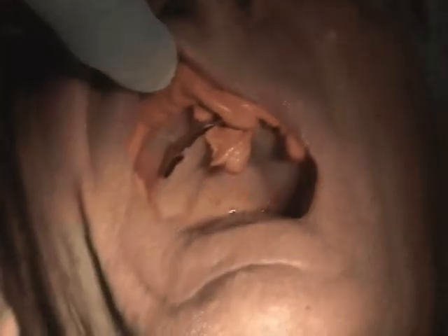You see that? We're going to syringe the material all the way back to the buccal. Just have the patient relax his lips a little bit into the palate, and then we take the heavy body and we start it from the front. Relax your lips, and just watch the roll go up into that buccal fold, and just gently seat it and roll that material over.